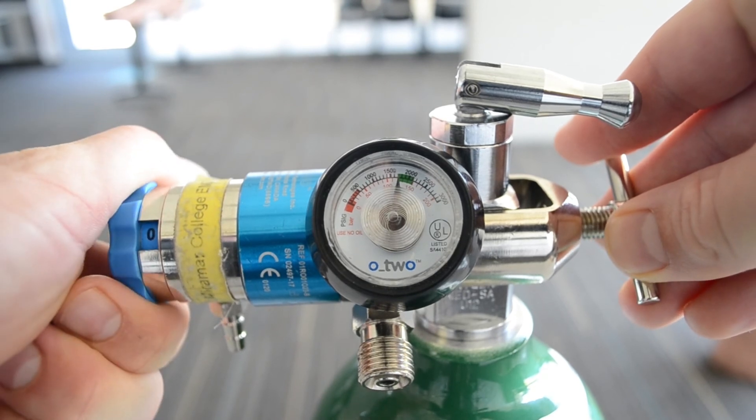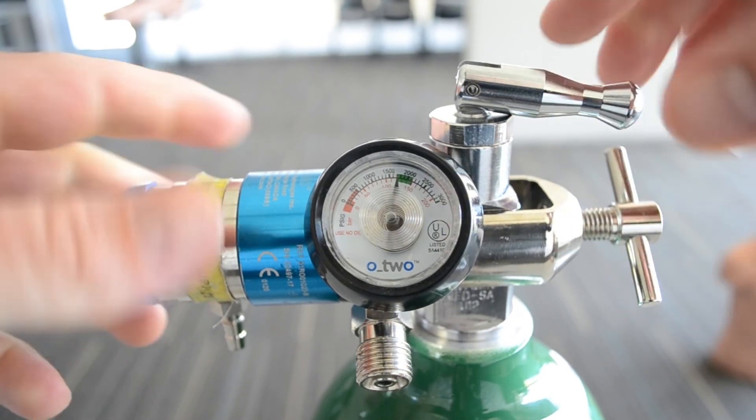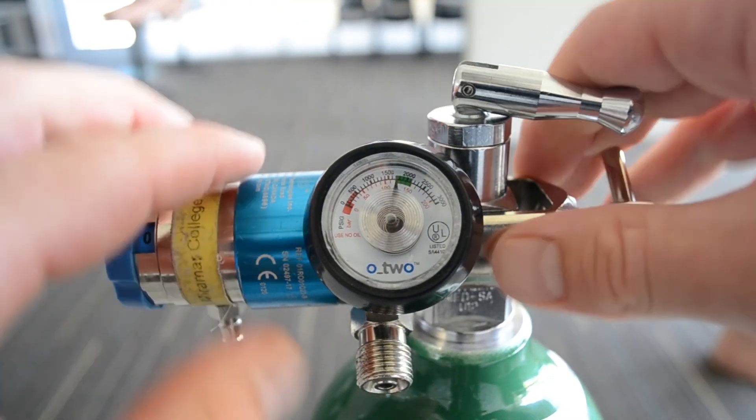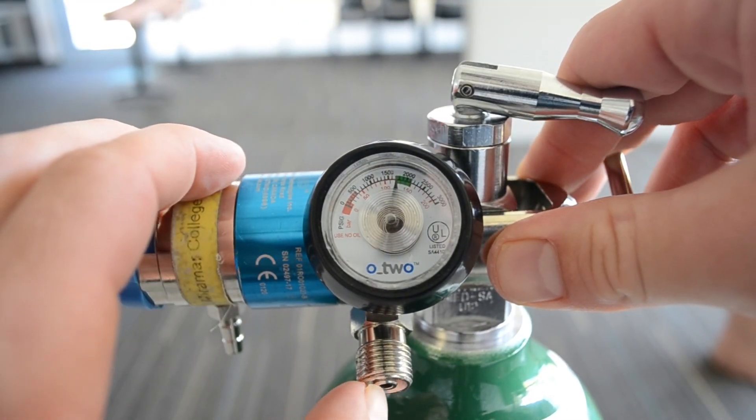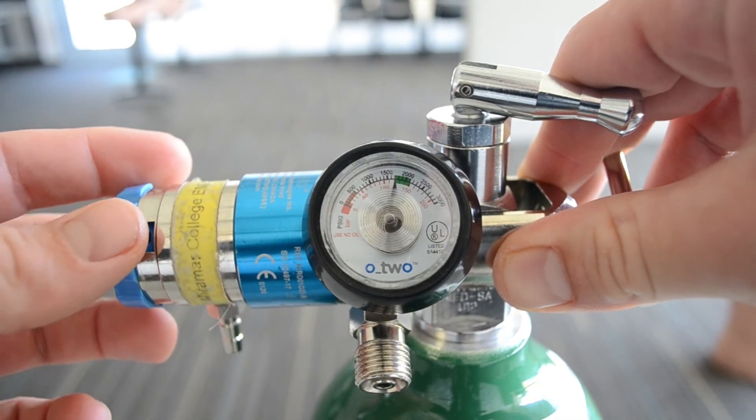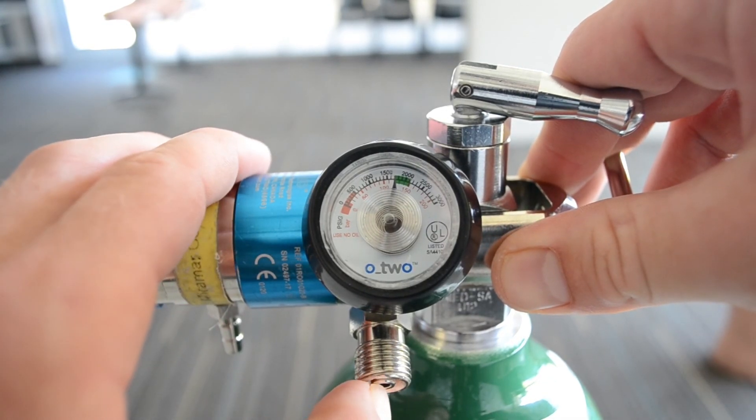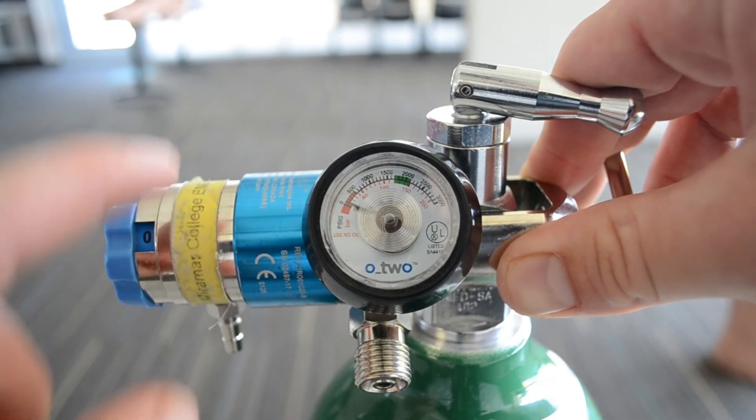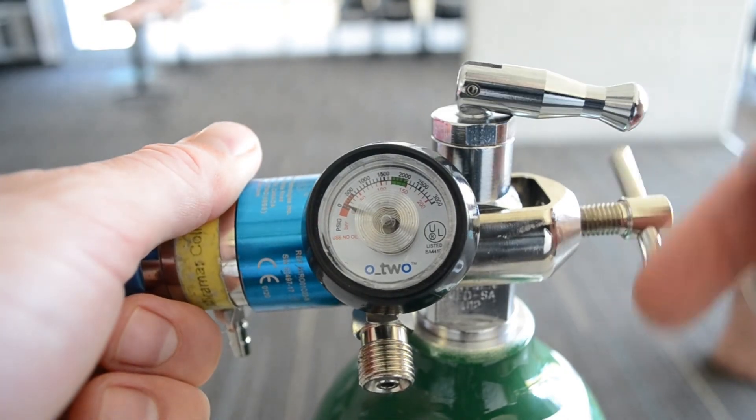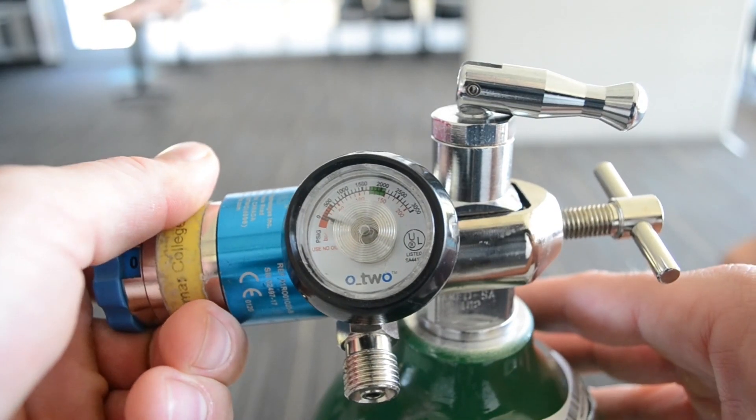When you're done, simply turn the regulator back to zero. Tighten this up one full turn. There's a little check valve here that you can press in or you can just open this up. I'm going to press this in because it's faster. So we release the pressure that was left in the regulator. Now we can take this off and remove it.